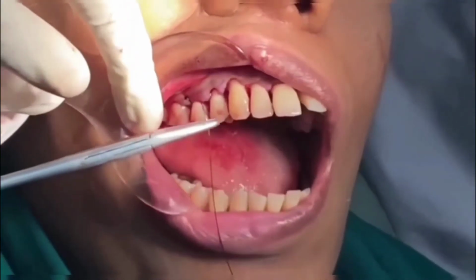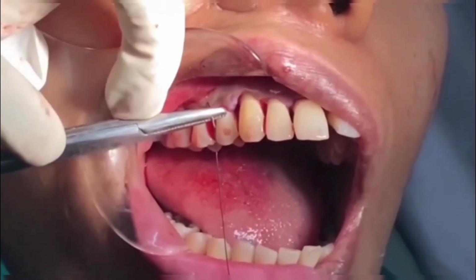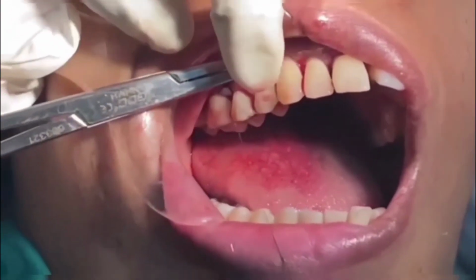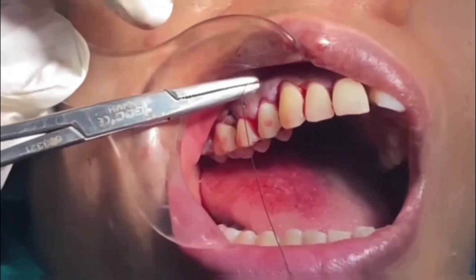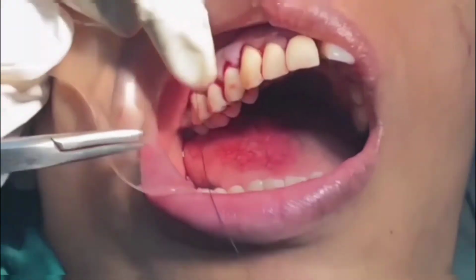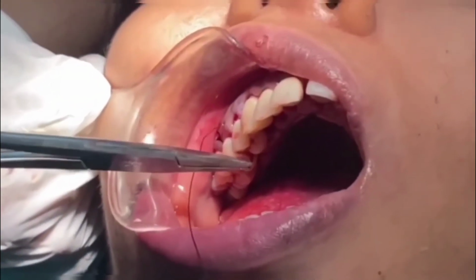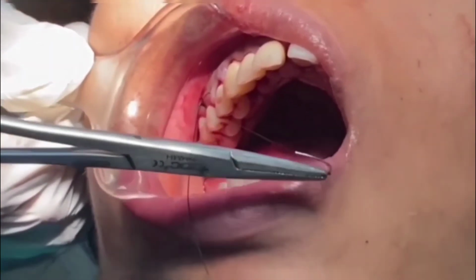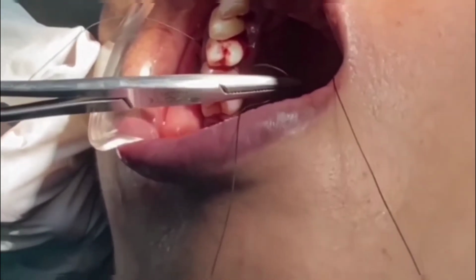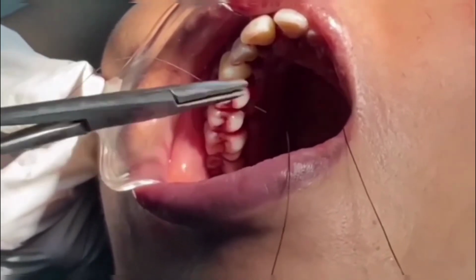Mersilk 4-0 suture was used for the flap closure. First, the suture needle was inserted through the buccal flap at the base of the papilla, and it was taken out from the same side of the incision. Next, the suture needle was inserted into the palatal flap, directing it towards the buccal flap.